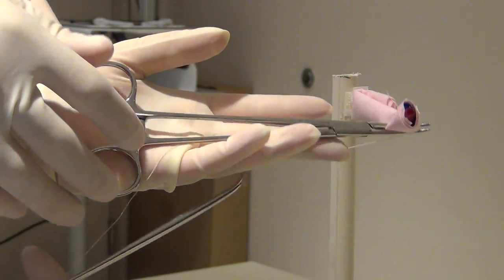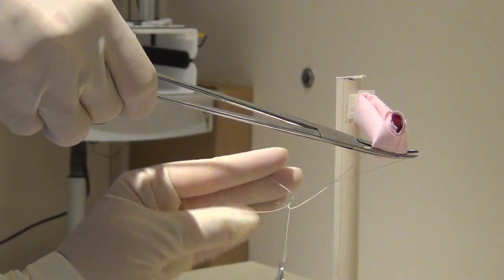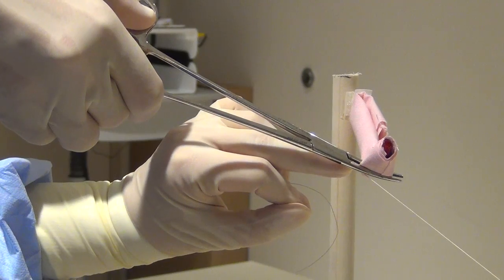In this version, the surgeon brings the tie in a passer around their own hand in the clamp holding the pedicle. They then securely tie a knot and push it down on the pedicle, and the clamp holding the pedicle is then removed.